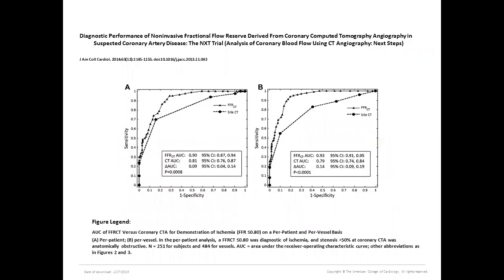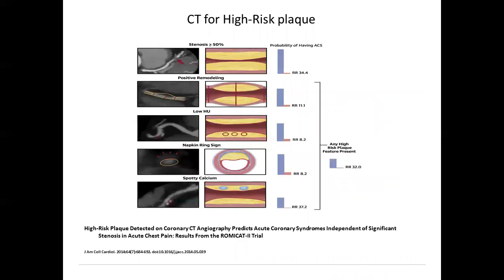So that was the DeFACTO study. This was the next trial, and it significantly increases area under the curve compared to visual assessment with CT. So I think as the technology spreads and costs come down, this is really going to be just like FFR in the cath lab. So that's going to be great. You can also do virtual stenting as well, and see how they'll respond to that. So there is a lot of exciting stuff that can happen with this.